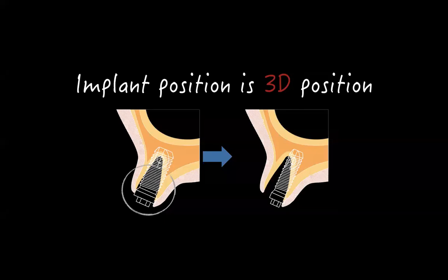The wider the implant, the stronger the implant, but that did not turn out to be the case because generally speaking, cases like this, you will see in your office where patients come with a gray area on the buccal surface of that implant. So if the patient has a very thin bone, very thin tissue, all of a sudden you see this grayness of the implant.